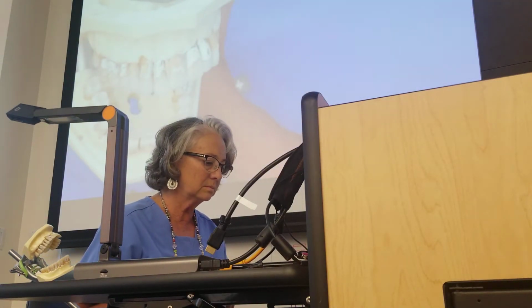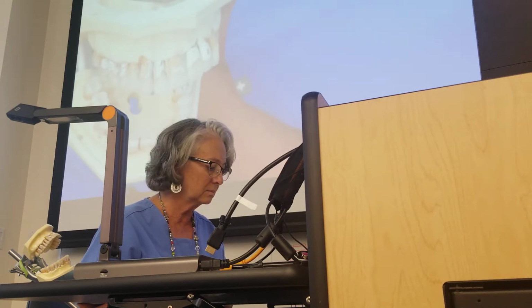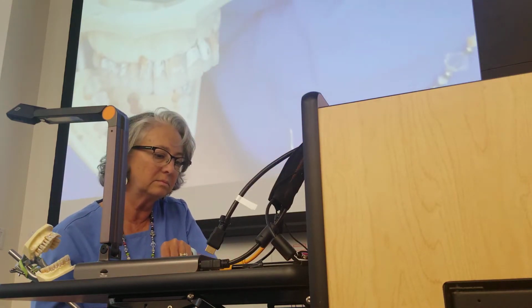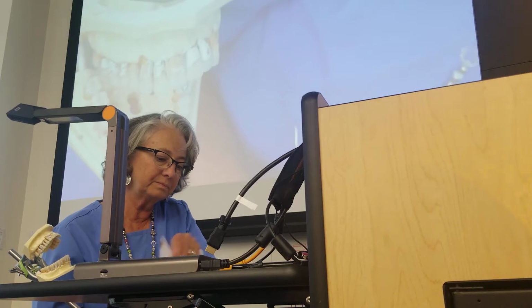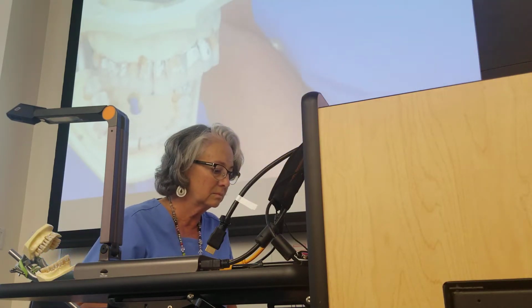Yeah, as long as you... What do you mean? For interiors? Are you doing the same side? I don't know, what teeth are we doing? That makes sense. So the toes are coming at me, right? This is the inner edge.